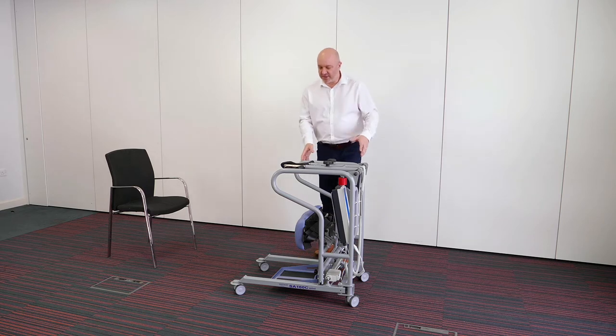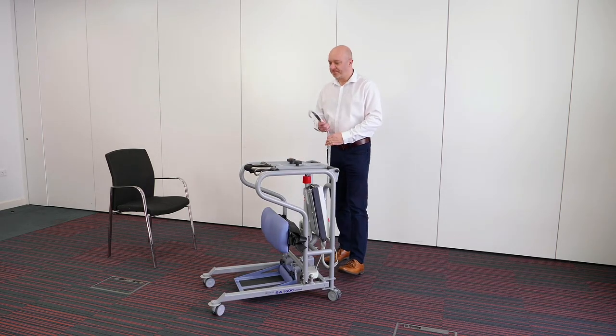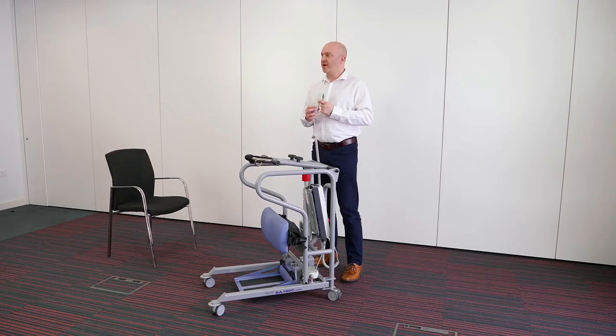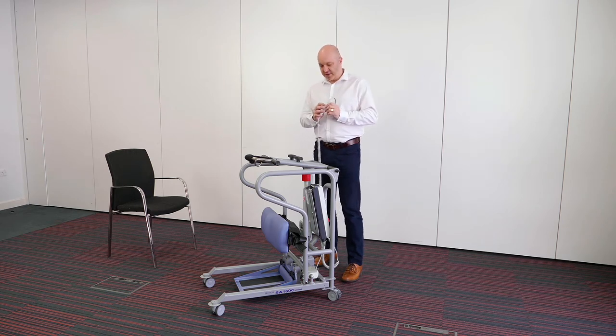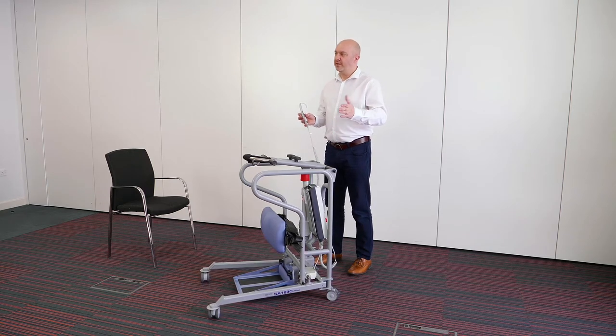So if we go down to the unit to start with, we'll have a look at the functions and the features. First of all, we've got the handset — it's a four-button handset. Up and down will obviously stand and sit somebody; it operates the boom at the top there. Up is up, down is down, and then there are two buttons on the left and the right for open and close of the base unit. If we press to open, the legs will get wider, and if you press close they will close again.